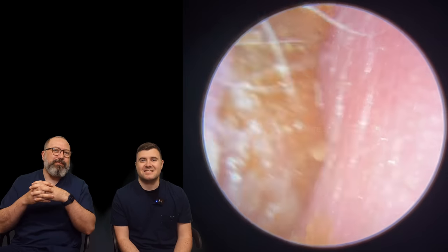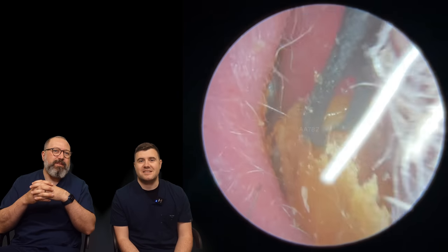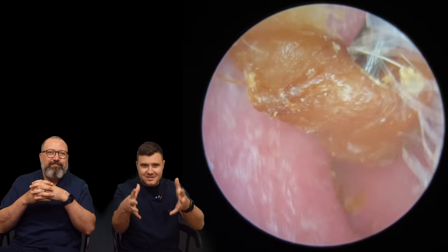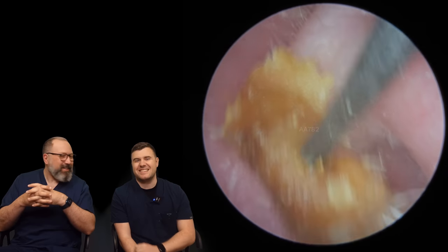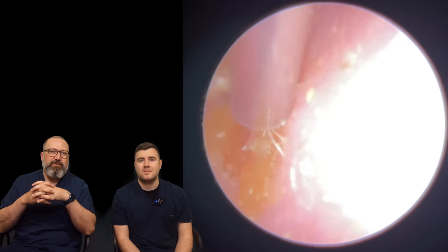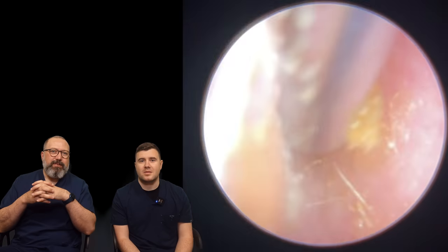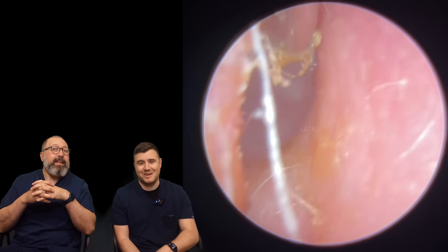So we switched up to the Jobson horn, which is great to get these little plugs out. There we go, out that comes. You normally find it just kind of goes in and then opens again, and that's why they generally tend to be a little bigger just as you come into the canal. That plug has come away. We've just got a little bit of tidying up to do on the outside edge — just hoovering up these little bits and bobs.